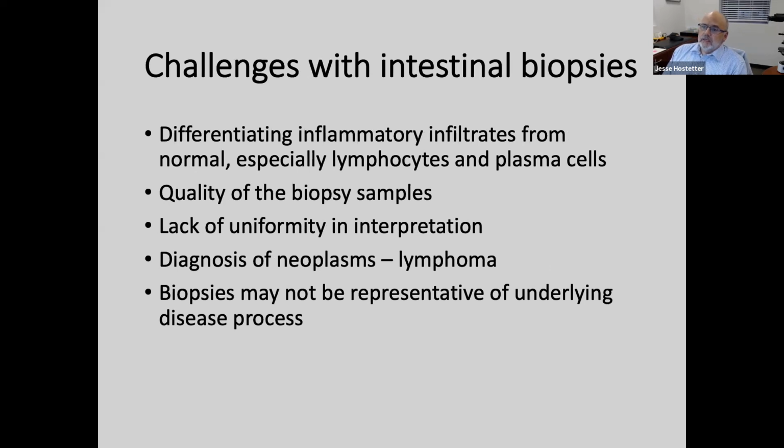I think everybody has their favorite and least favorite biopsies to look at. For me, my least favorite is clearly bone. I like GI biopsies, but I find when I work with residents, and I've worked with them over a number of years, that GI biopsies often are, at least at the beginning of the career, one of the least favorite. I asked myself when I was preparing this presentation, why is that the case? I put a list together. These aren't all things that I've come up with; these are things that I've read about as well. But there are a number of factors that really make these difficult to read.